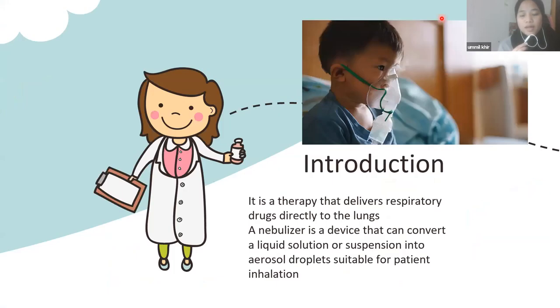So what is nebulization? Nebulization is a therapy that delivers respiratory drugs directly to the lungs. And a nebulizer is a device that can convert a liquid solution or suspension into aerosol droplets that are suitable for patient inhalation. Next.